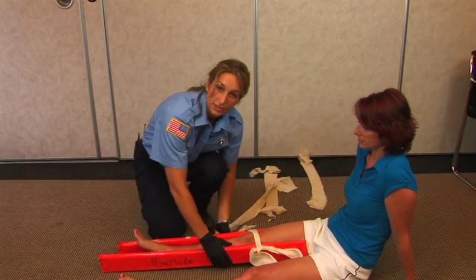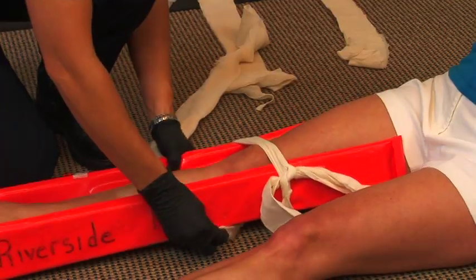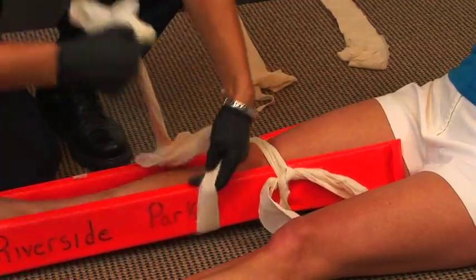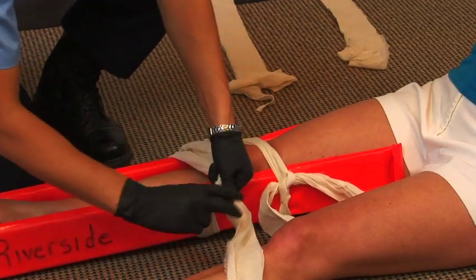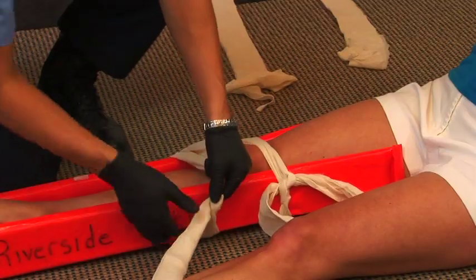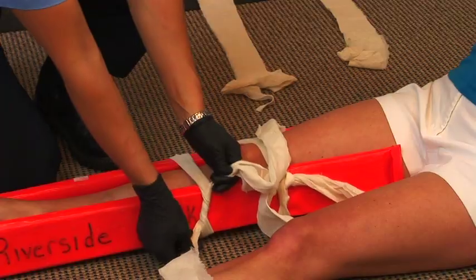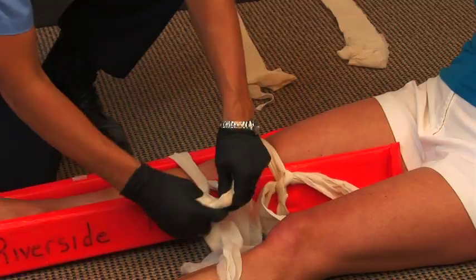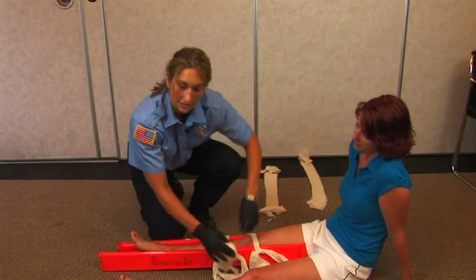You'll also want to place a cravat above the area of the break. It's easiest if you wrap this part twice, and this will actually hold your original overhand knot.